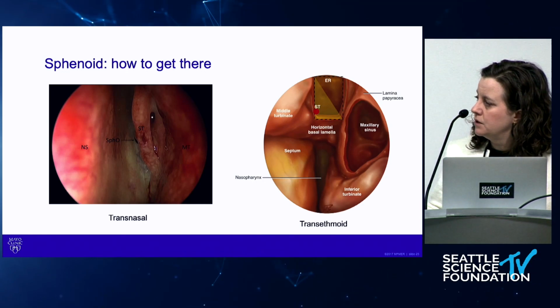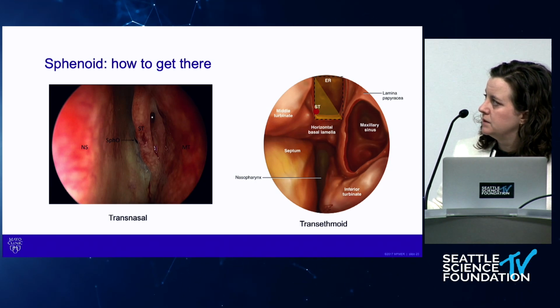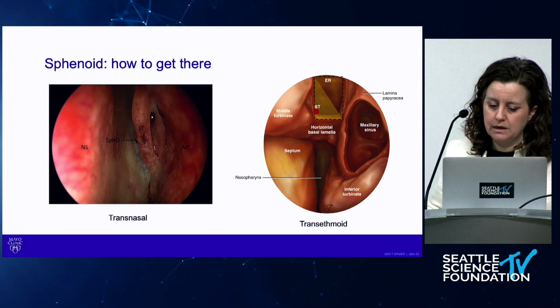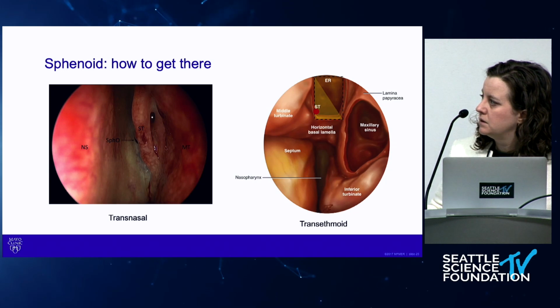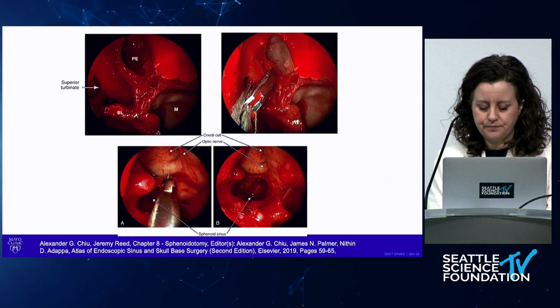I tell the residents there are 2 ways to get there. You can go through the ethmoids, like we were talking about. Take down your basal lamella, the top of the maxillary sinus, medial and inferior here. That's the trajectory to the sphenoid. But if you're having trouble finding it, then go transnasal. This is your superior turbinate. You're going to find that os. You can use both techniques to get to your sphenoid.